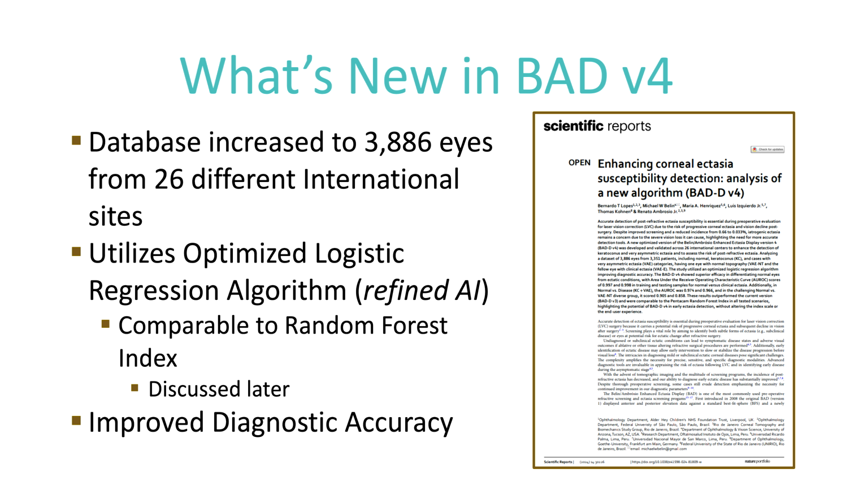What's important, you may read a lot of literature and you'll see terms of a random forest index. That's another way to interpret the data. The problem with a random forest index is it requires a change in the user interface.